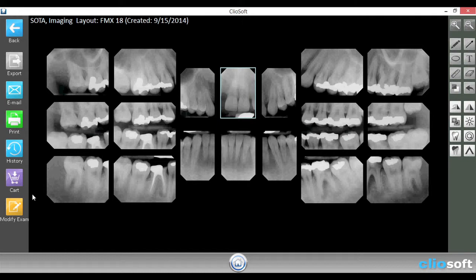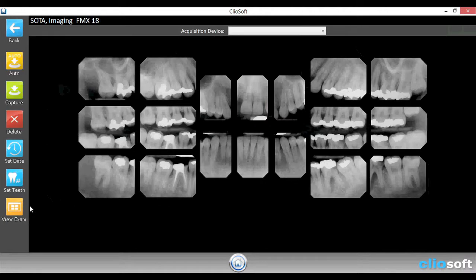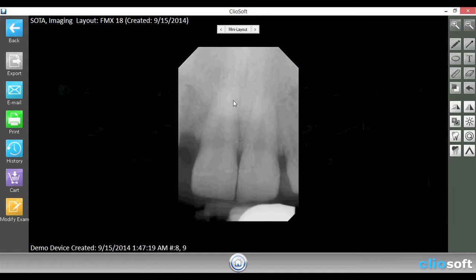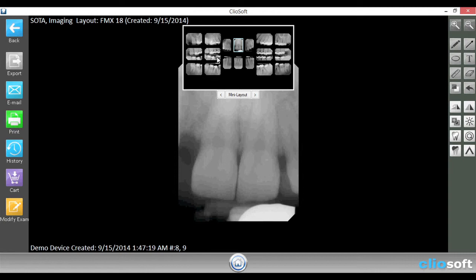You'll notice that we also have a modify exam button down here, and the modify exam button will basically just switch back and forth from actually acquiring images to viewing the exam. Also, once you're in the view exam mode, you can switch from place card to place card easily by this mini view sheet.